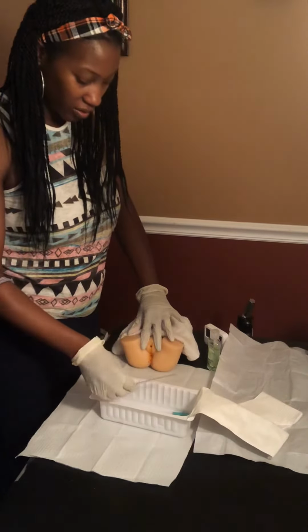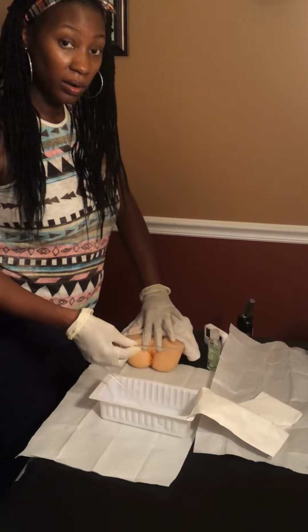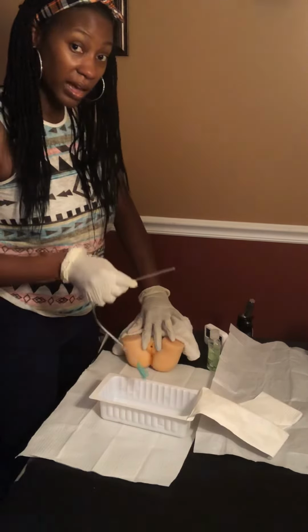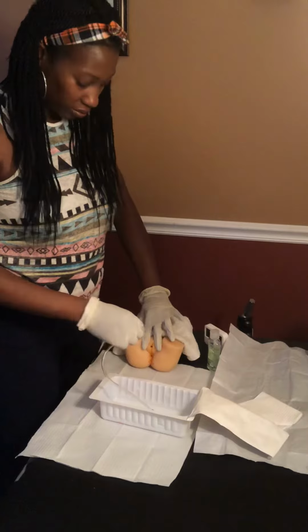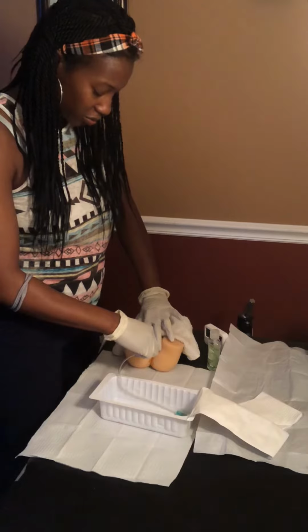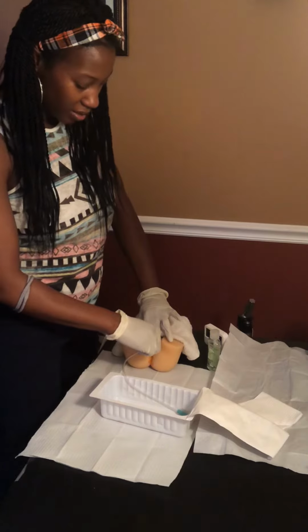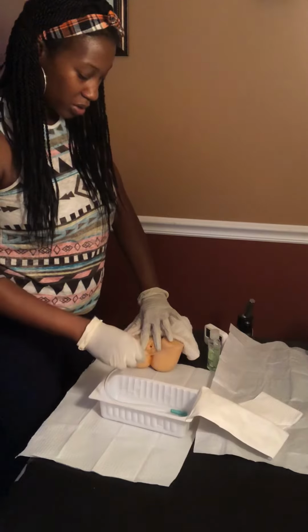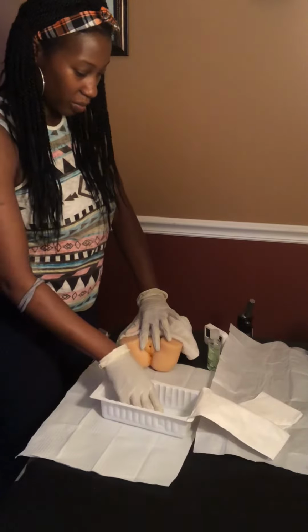Put it 2 to 3 inches. I would place my hands, my fingers where, I hope you can see. Leave that in the receptacle so the urine can drain out there. So place it in there. 1, 2, 3 inches. Oh, urine is coming out. That's good. Take it out. Put it in the receptacle. Move that out of the way.